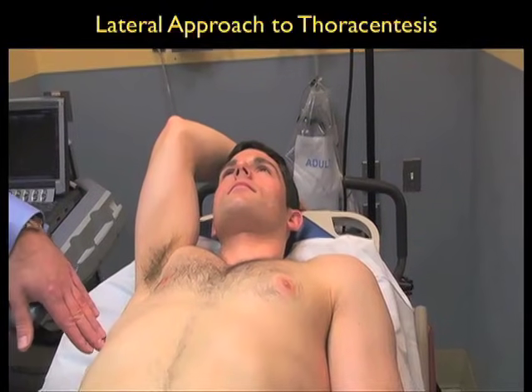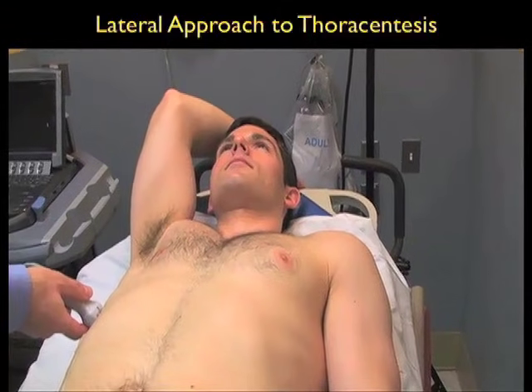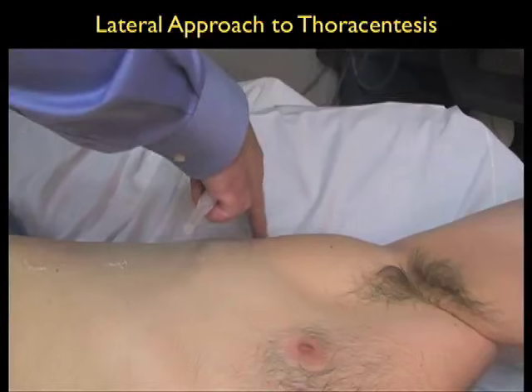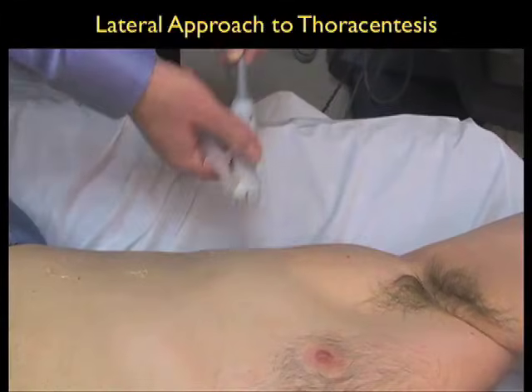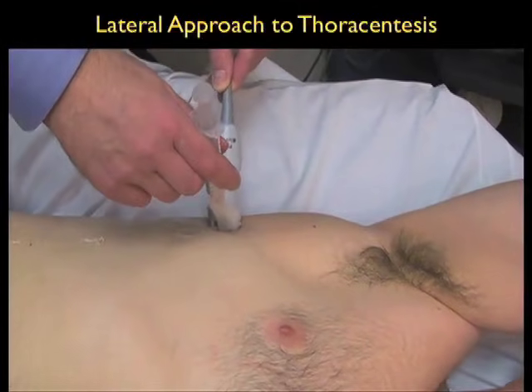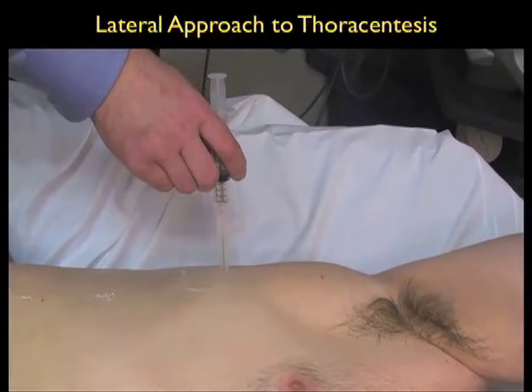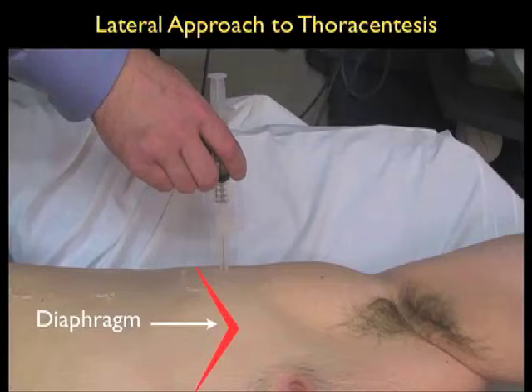Here I'm demonstrating the appropriate position of the probe to investigate for the lateral approach to the thoracentesis, this time on the right chest. Notice the positioning of the 3 megahertz probe on the lateral chest wall right above the level of the diaphragm to look for a pleural effusion. Here I'll indicate the orientation of the ribs across the lateral chest wall and here's about the orientation of the diaphragm. Remember that the diaphragm will move up and down as the patient breathes, so we want to place the probe above the level of the diaphragm to look into the thoracic cavity for a suitable collection of fluid. The needle should be positioned above the diaphragm so it can safely enter the thoracic cavity and not cause a complication such as puncture of the diaphragm.